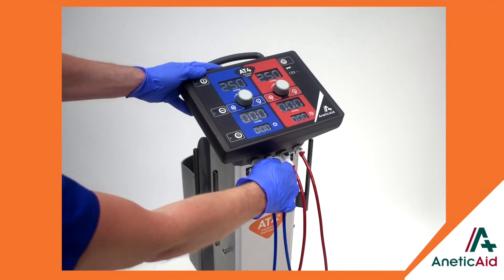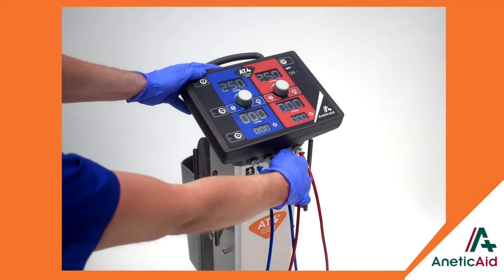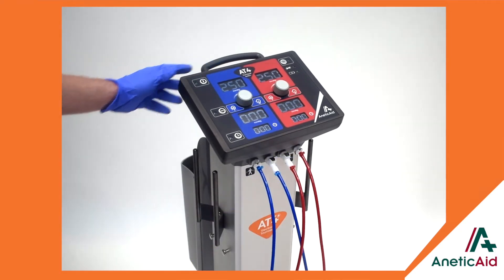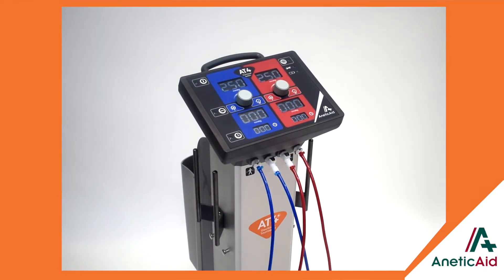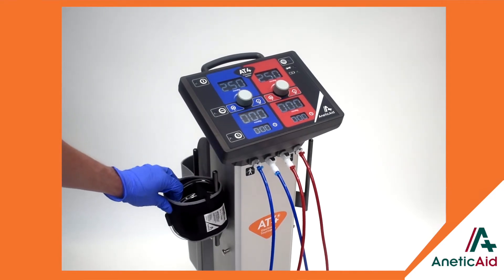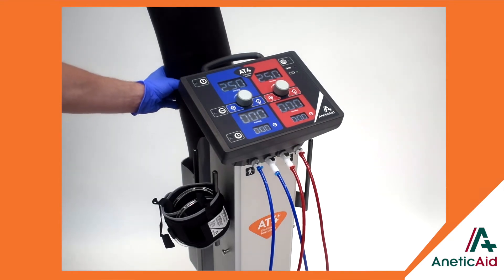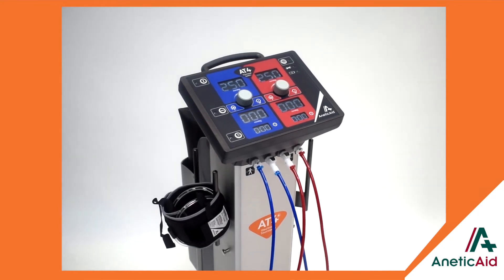The AT4 has convenient storage as a standard feature. Cuff supply hoses are provided with a dummy connector home position. Cuff storage hooks are mounted on either side, and a rear-mounted storage facility is ideal for the Rhys-Davies Exsanguinator or other items.